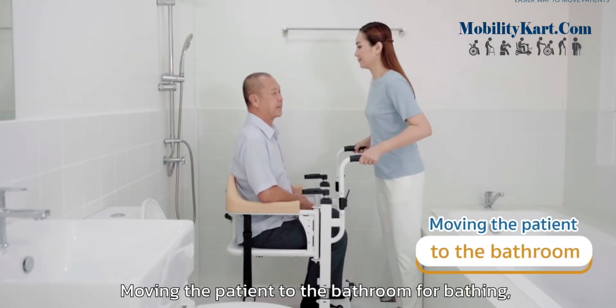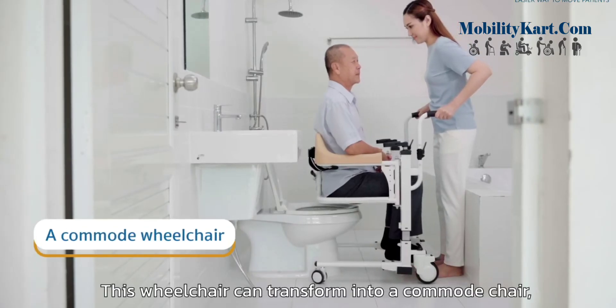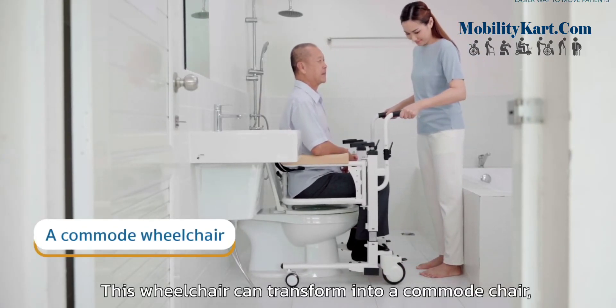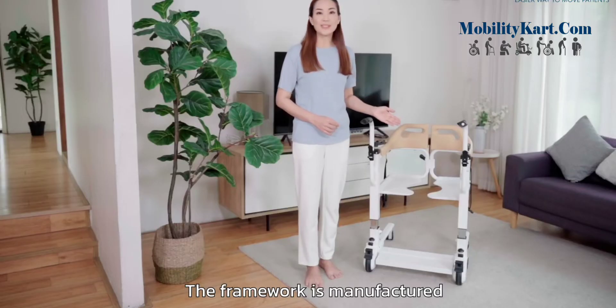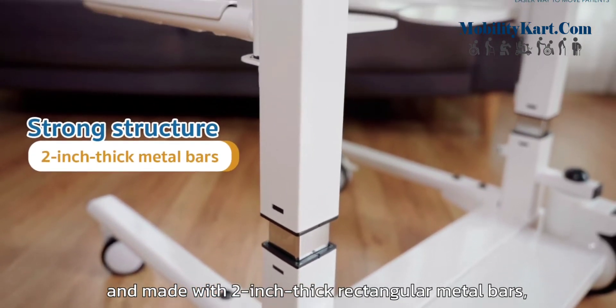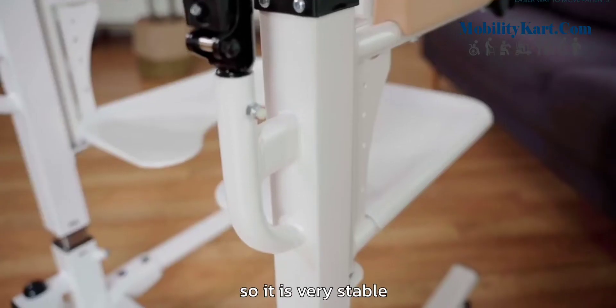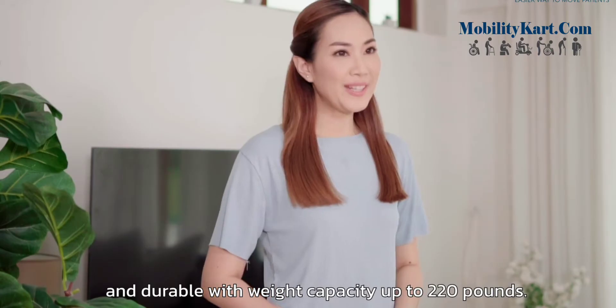Moving the patient to the bathroom for bathing or moving to the toilet. This wheelchair can transform into a commode chair, and it is also waterproof. The framework is manufactured and made with 2-inch-thick rectangular metal bars, so it is very stable and durable with weight capacity up to 220 pounds.